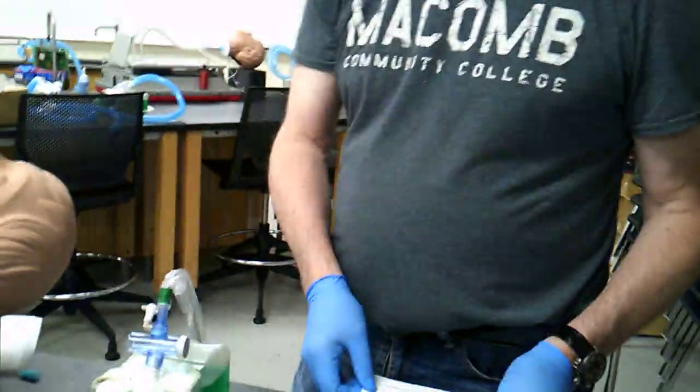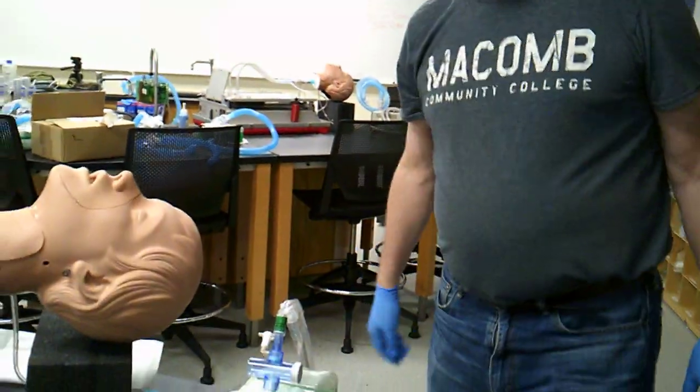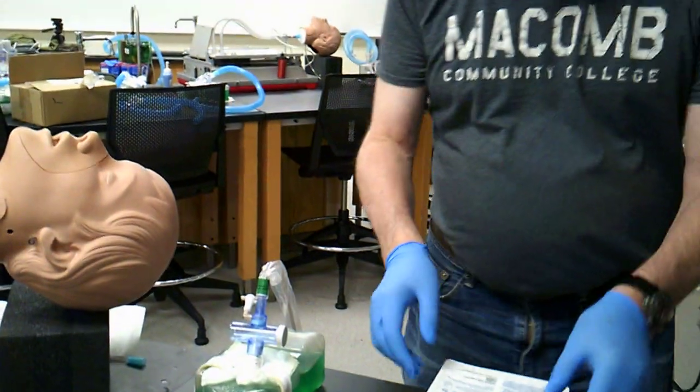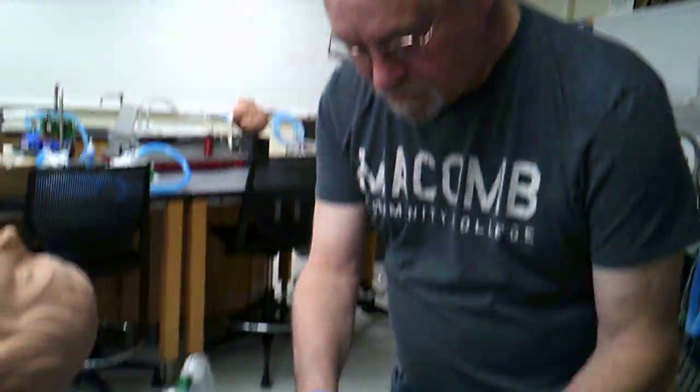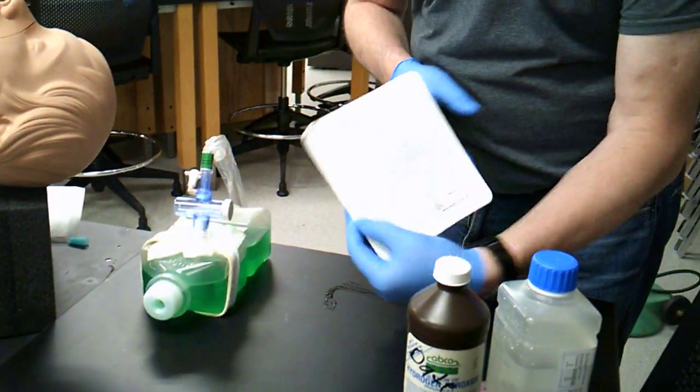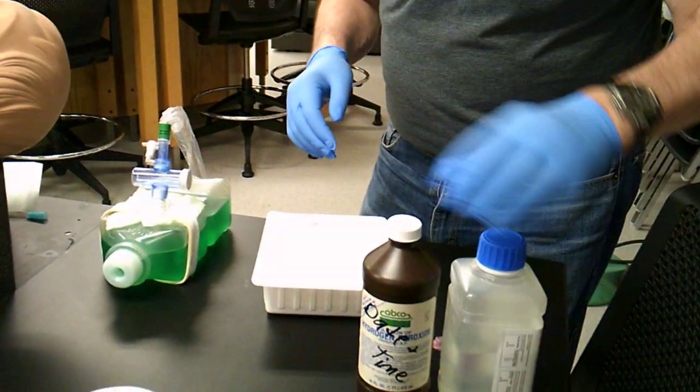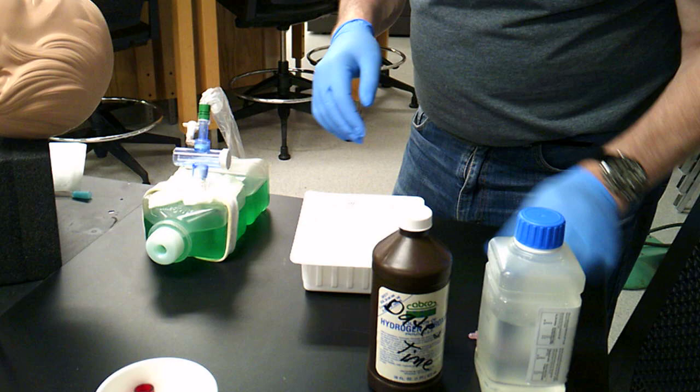I stopped it and then, okay. Trach Care. We'll start off by having our Trach Care Kit. We'll have a bottle of sterile water and a bottle of hydrogen peroxide.